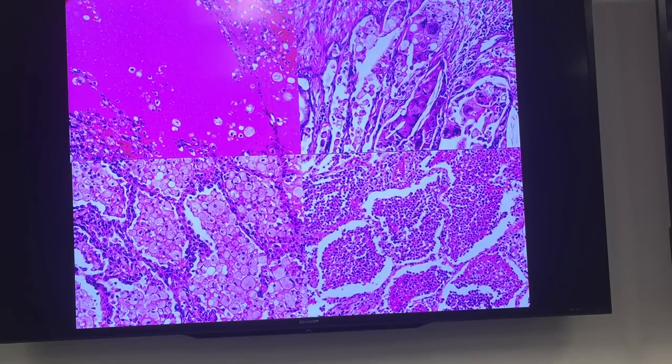Okay, clear to everybody? What about the bottom right? What is that? Yes, that's an acute pneumonia. I call it acute bronchopneumonia again, because most of the time, what's in the bronchioles is also in the lung, so it's one process. What you have in the air spaces in that, all of you have seen this at autopsy: neutrophils, fibrinous debris, bacteria and stuff like that, which you can pick out on a gram stain sometimes. This is the classic appearance of an acute bronchopneumonia, and that is a classic airspace disease, right?